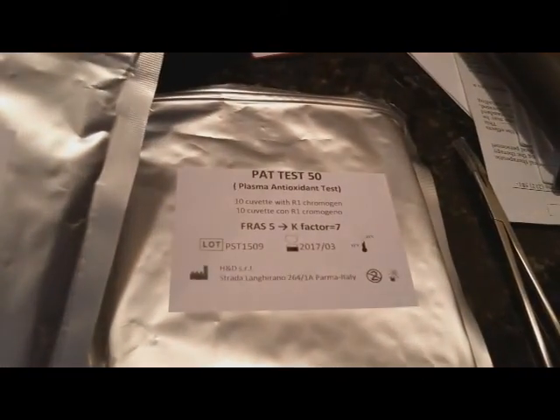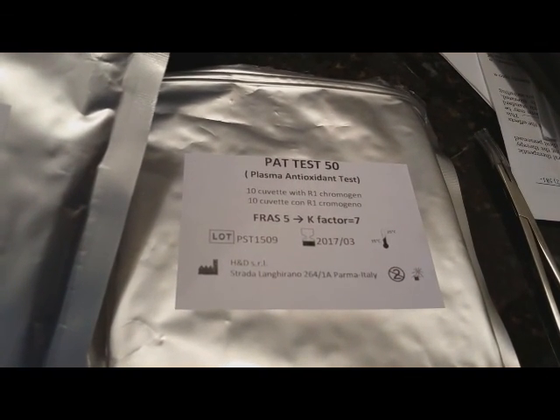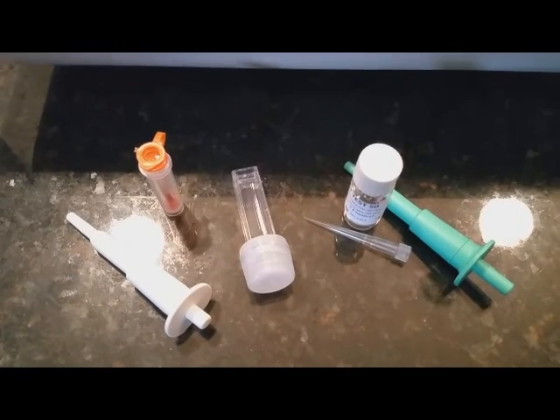Now we're going to do the antioxidant test — the PAT test. I've gotten out all of the supplies needed. The PAT test has its own separate reading cuvettes with its own correction factor — notice it says K factor is 7. We'll also need some micropipettes, a different reagent, and we've already got our blood sample, so let's go ahead and do that.